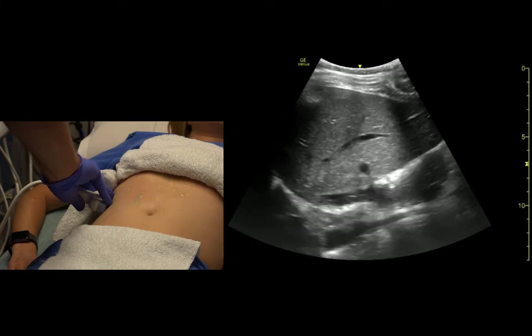If we get high enough, we can see the aorta and the IVC from a coronal section.